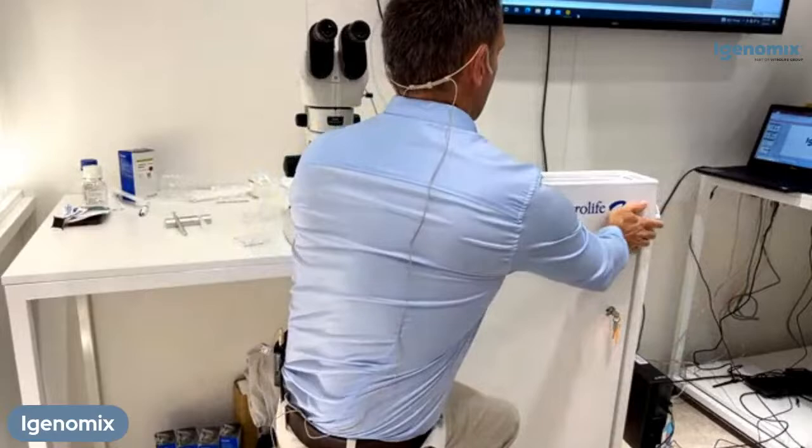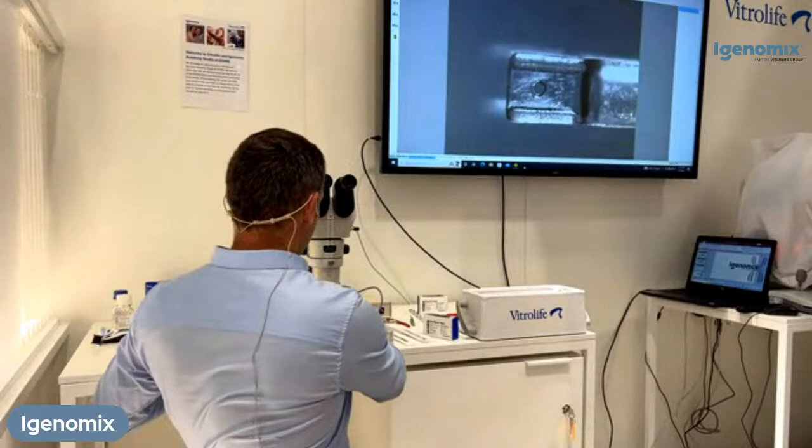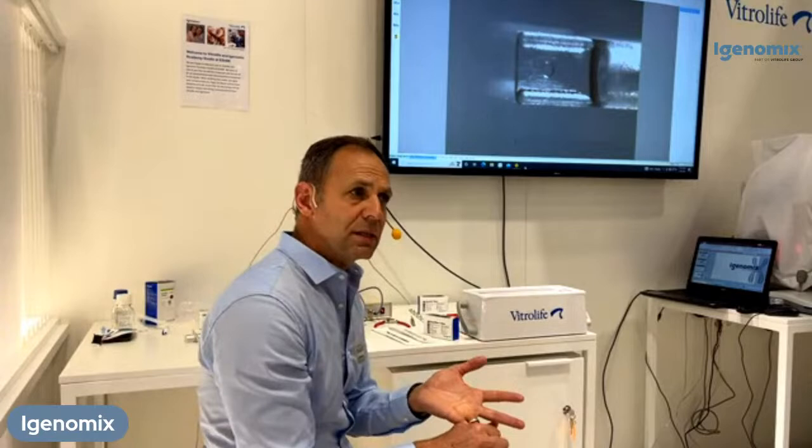I will now go through the actual protocol step by step. I'm not going to keep the timings because we are not working with embryos today, but I will use glass beads as they are much more visible on the screen. I have already prepared my vitrification dish with my media. Remember to validate in your own lab how long it takes to reach 37 degrees Celsius in the media. Because we have MOPS in our media, pH is controlled; because we work at 37 degrees Celsius, temperature is controlled; and because we work in a large volume, osmolality is controlled. So it's a very safe environment for your embryos.